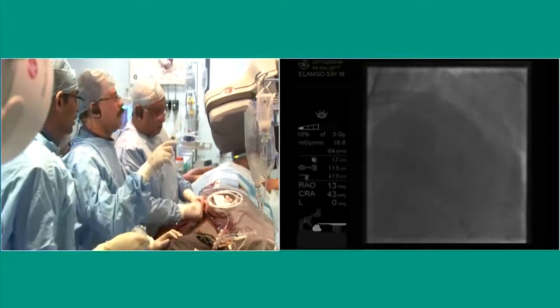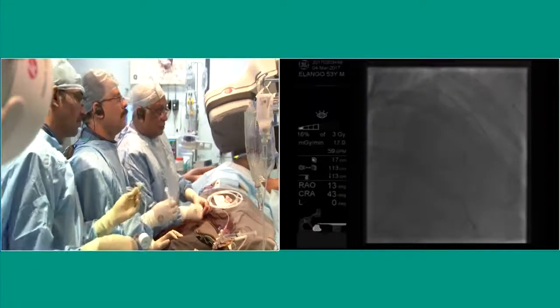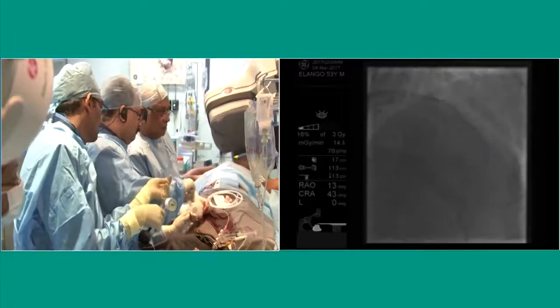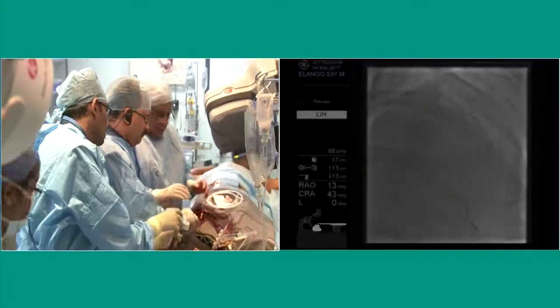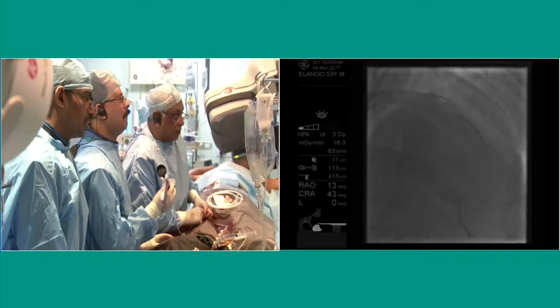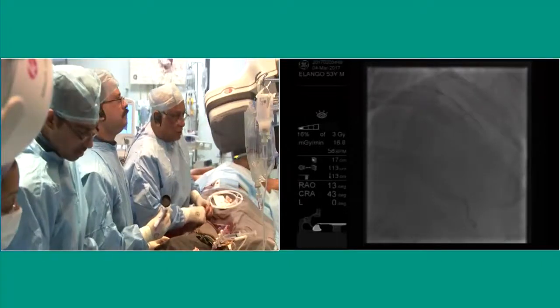What I've done is I've selected a newer generation stent. Which one is that? The other stent was not very smooth. What is the stent we have taken now? It was the plain Xience. What stent? Xience V. Yeah, because we didn't have the optimal size. So what size is this? 2.25? What is the size? 2.25, 2.5 by 14. Which one is this?